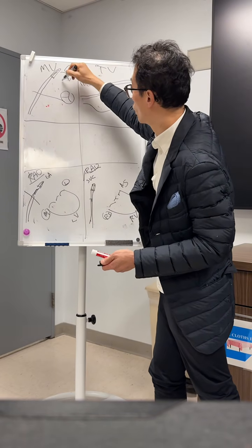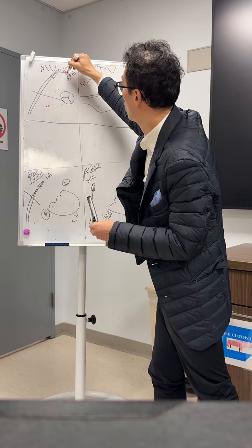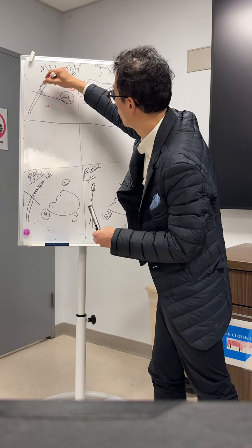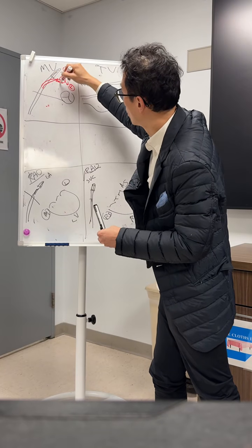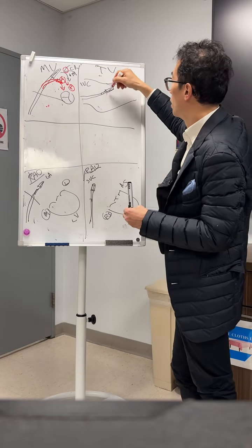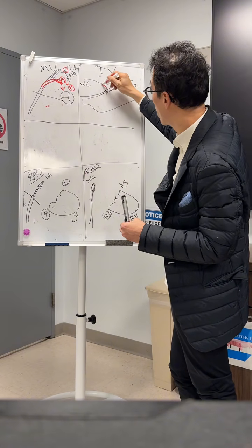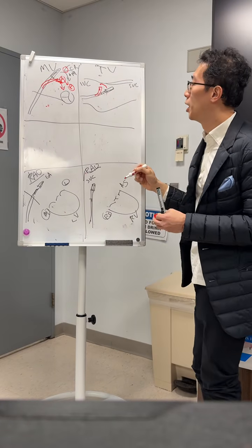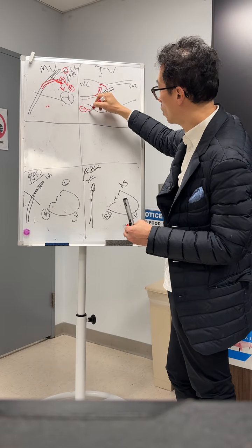Initially, you want to have a little bit of anterior guide torque to clear this portion. So you go anterior, and then you go posterior guide torque. So basically, you try to get going this way down to the mitral annulus. Here it's going down to the tricuspid valve, so you need to go this way. Okay? So first thing what I do is typically you want to go from negative on the guide to neutral.